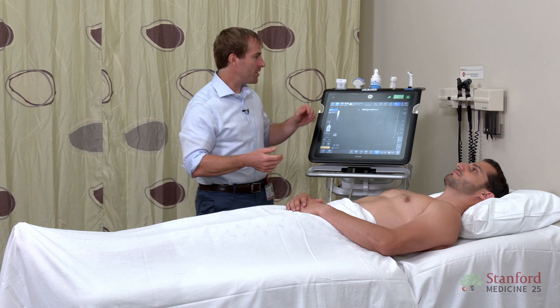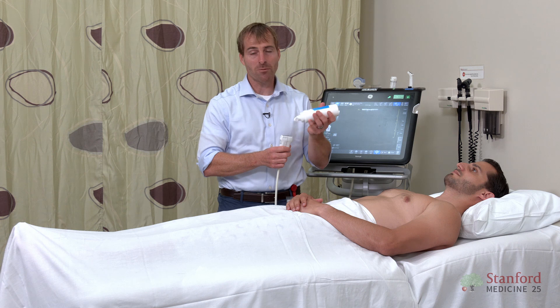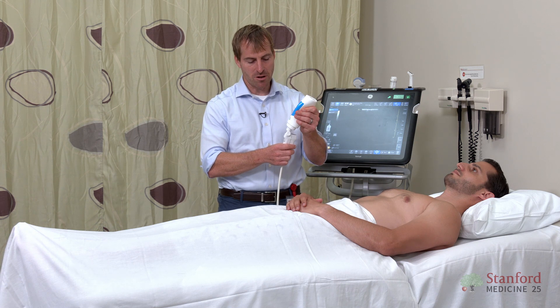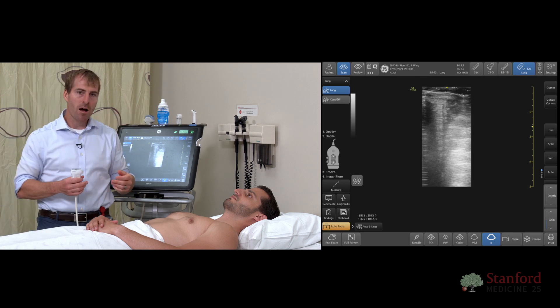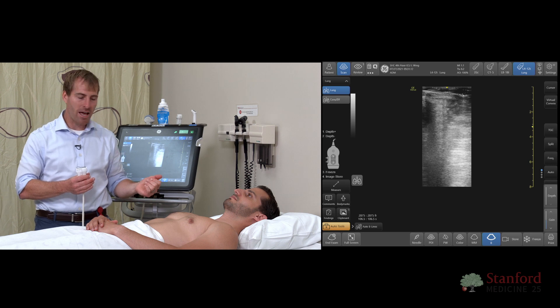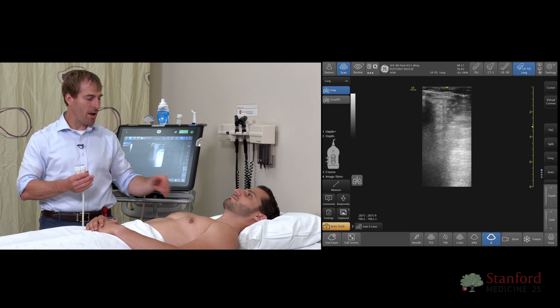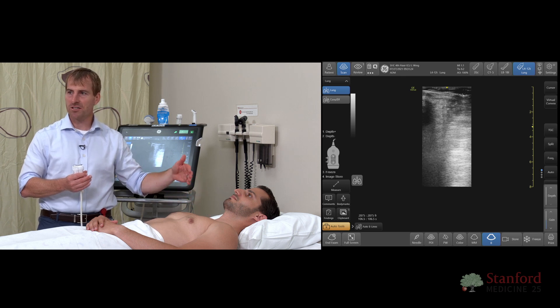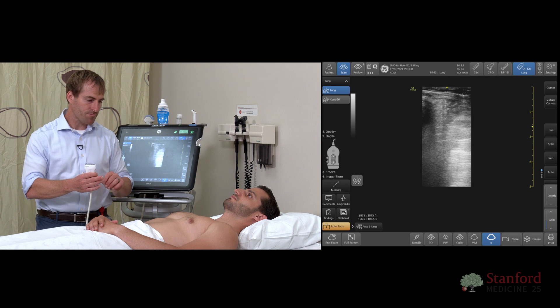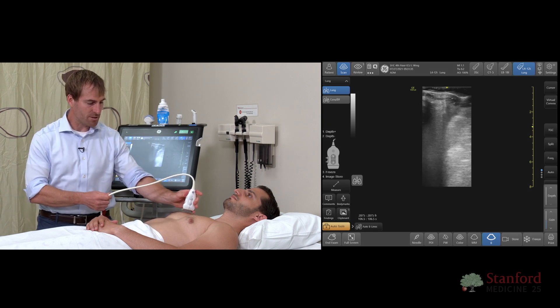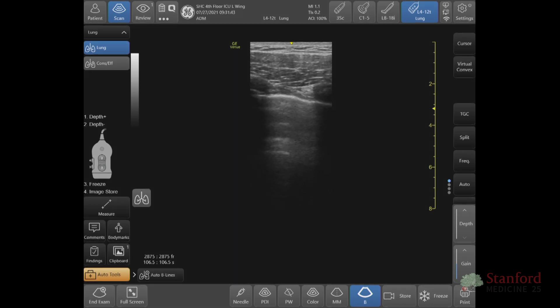To get started, we'll position our patient and grab a probe. I'm going to show you using a linear probe today, though you could do this scan with many different probes. When we position our patient, we'll usually have the patient lying flat. It's really important because air is going to rise, and we want to put the probe where the air would go. If the patient is sitting straight up, the air goes up to the clavicles where we can't see sliding well. So we scan with the patient lying flat, placing the probe across a couple of rib spaces at the highest part of the chest — this is where the air should go.